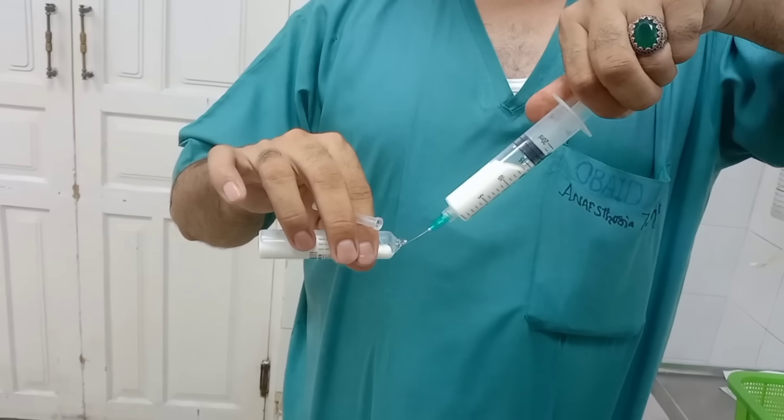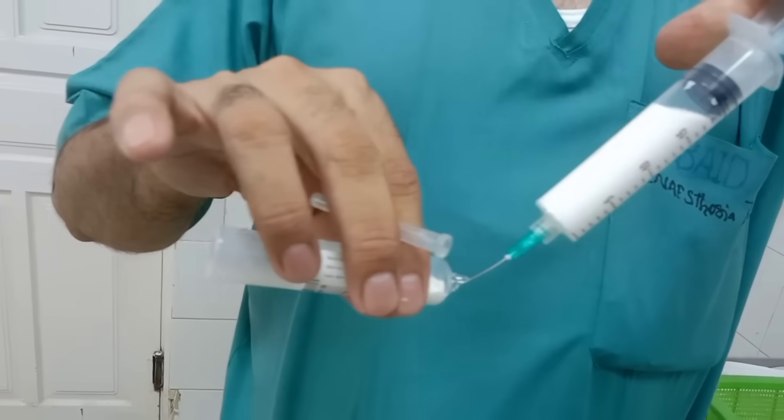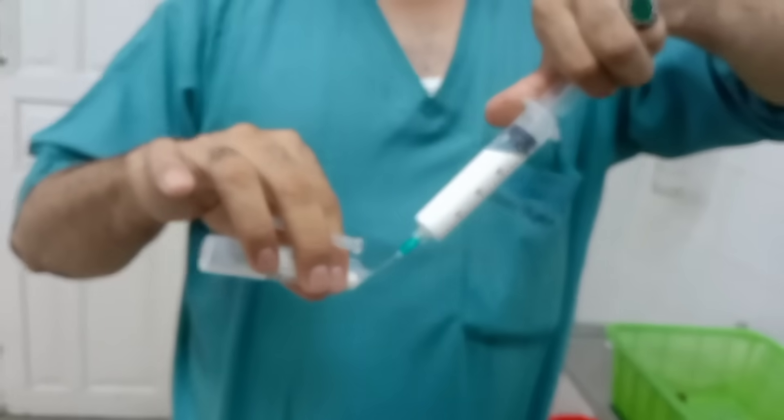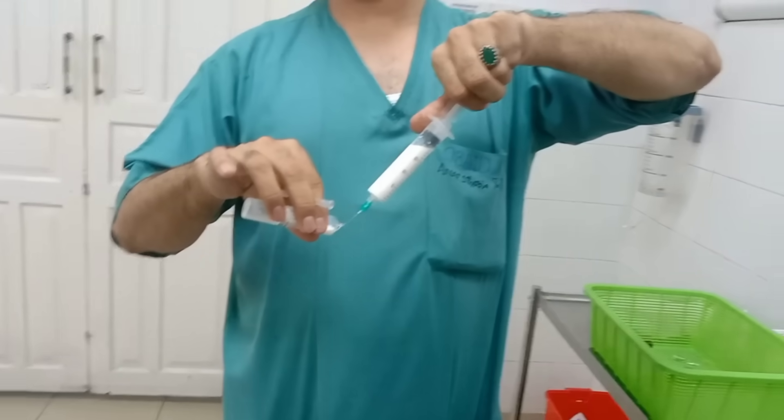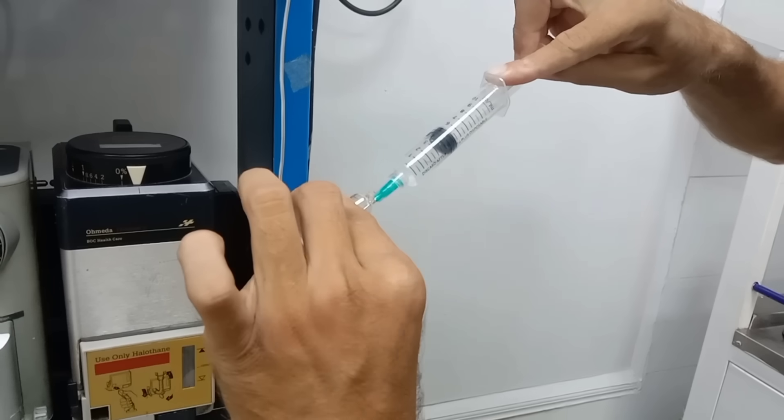IV line and fluids. After that, I inserted an intravenous cannula into the patient's hand and connected an IV fluid line — normal saline. This was to maintain hydration and also to have a route for administering anesthesia medicines.